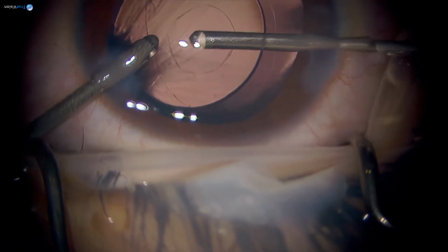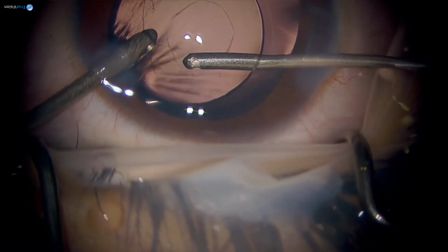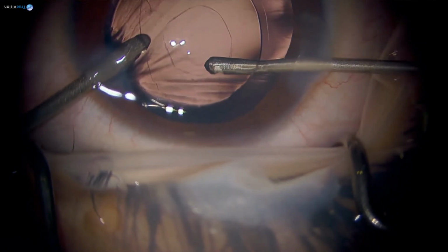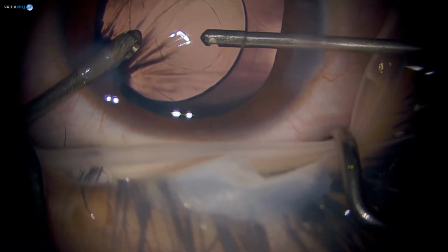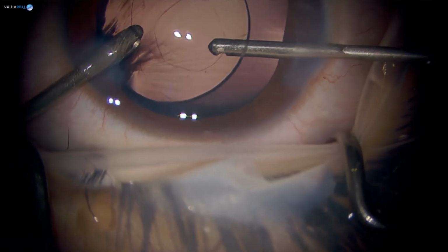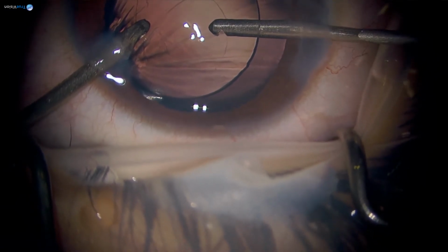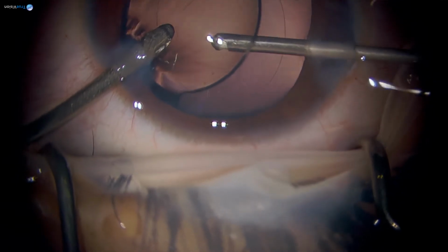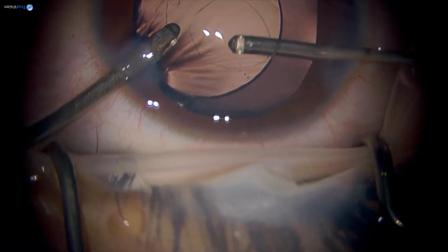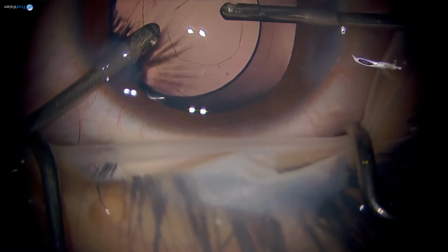I'm turning it like this. You can see this is a finger movement, not an elbow movement. This is very important. Sometimes in the initial part, this machine is so good that it just shaves off this posterior capsulorhexis. Again, I do not have any financial interest, but it makes my life very easy. Again, I'm stopping a little bit here, and then my fingers rotate in this direction.